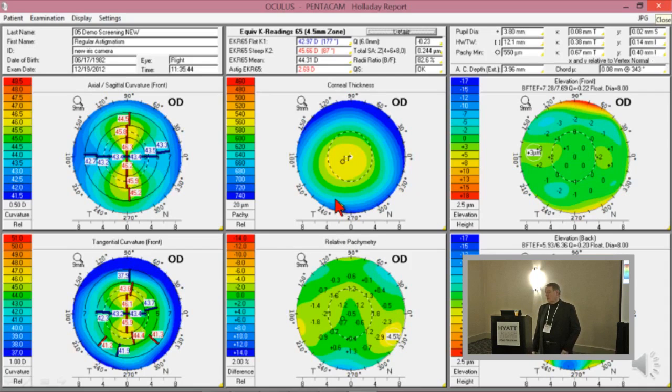Yes? The EKR, do you still have to put in the pupil size when you're doing your measurements? Well, we're going to see a picture of that, but the question was, what about the pupil size? Okay, now let's talk about that. Okay, so are we clear on the Zernike term to use? In other words, when you're trying to neutralize spherical aberration, that box takes the 40, the 60, and the 80 and adds them together and comes up with a value.